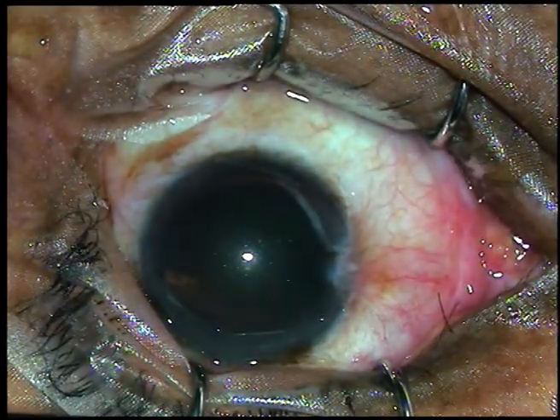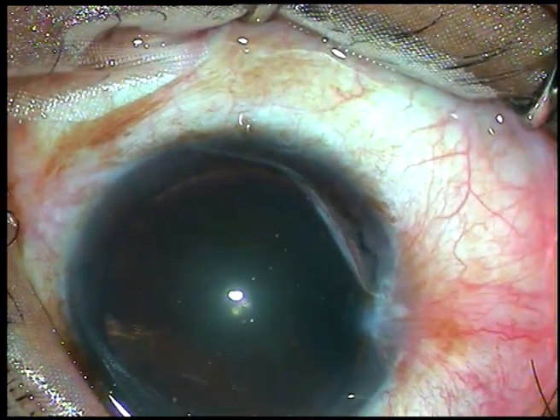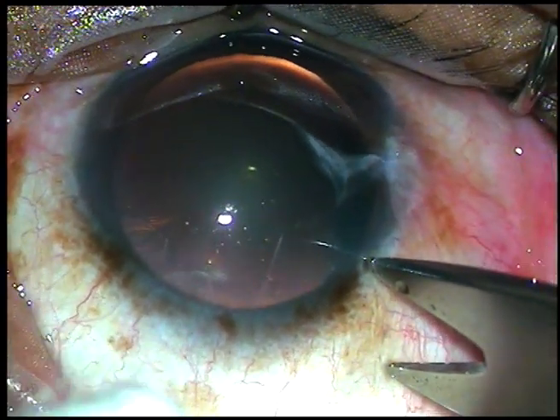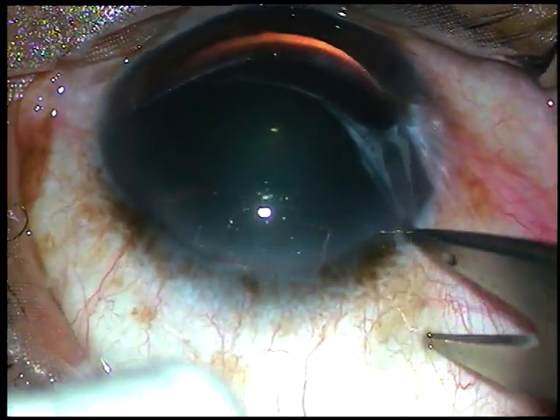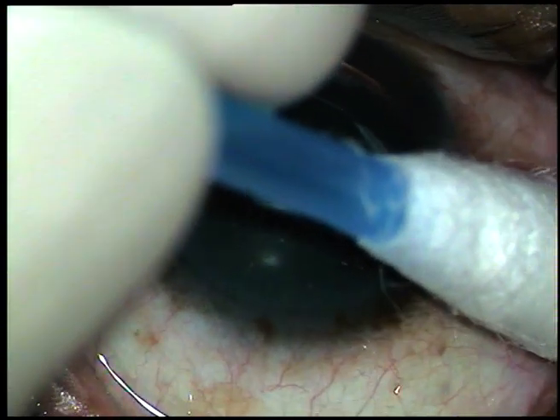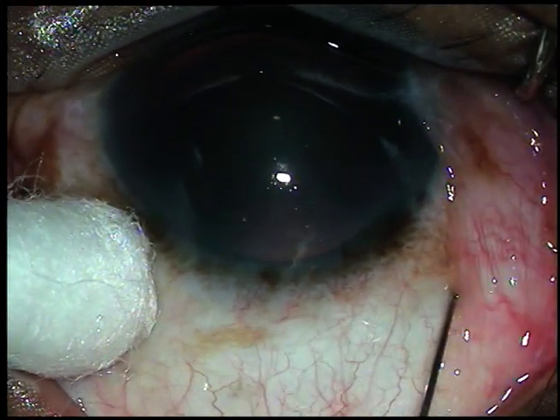And now, the measurement. This is a fake eye. A four millimeter measurement has been taken — this caliper shows four millimeters from the limbus. The other side of this caliper shows three point five millimeters. Since this is a fake eye, I have marked a point which is four millimeters away from the limbus. Now, conjunctiva is retracted.